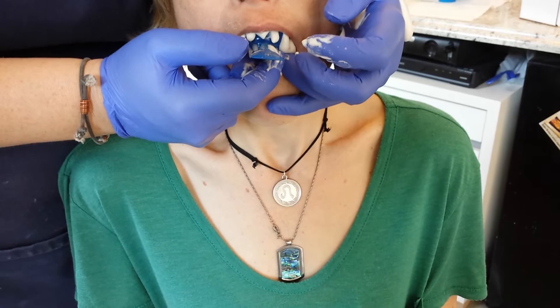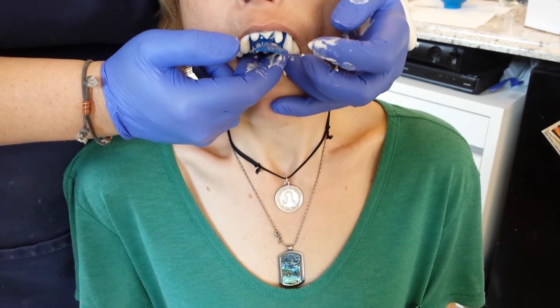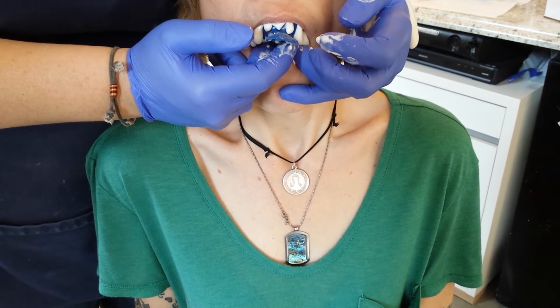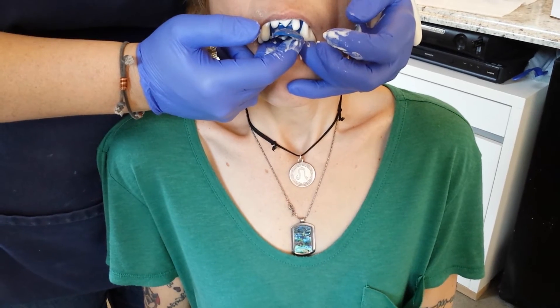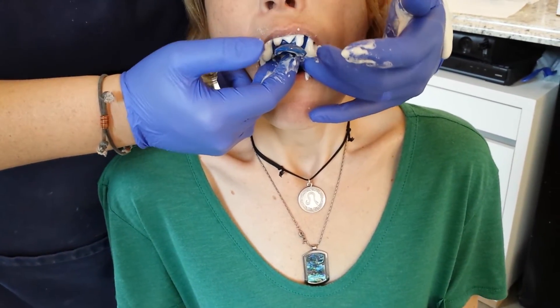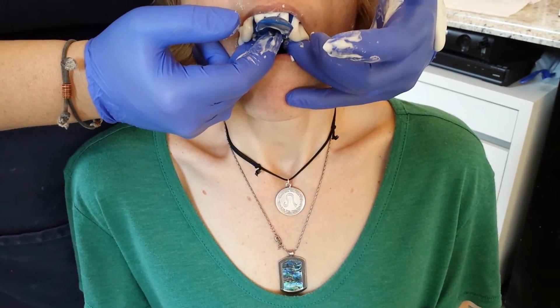This takes about a minute and a half to two minutes to set up. Make sure you check the tackiness of the impression material — don't go strictly by what the manufacturer says, that's just a ballpark. The warmth or coolness in the room can make that vary, and if the patient just took a cold drink of water, that makes the time vary too. You can check whatever's on your hand or check inside the mouth. If it's still tacky, do not pull it out — it's going to warp the impression and therefore warp the model, and we won't be able to use it in the lab, meaning you'll have to call your patient back for a new impression.